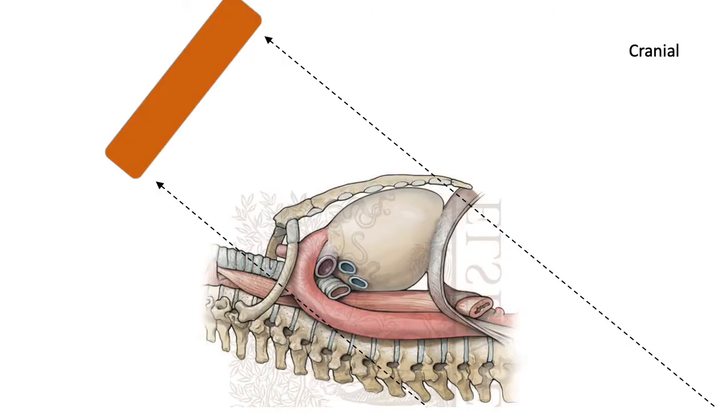The right coronary artery is engaged in a left anterior oblique projection. Then, an image is obtained in the same LAO projection, and subsequently a cranial view is obtained. Sometimes an RAO view is obtained as well. So here are a few tips.